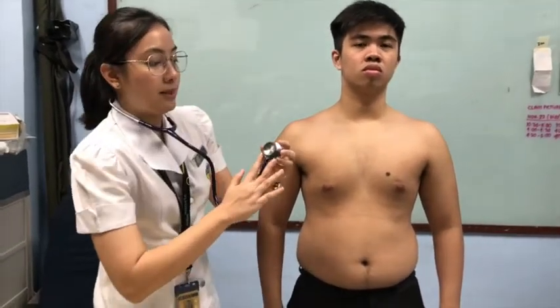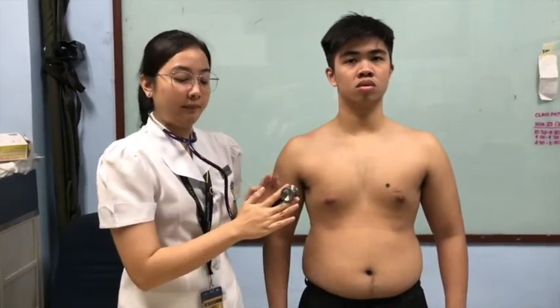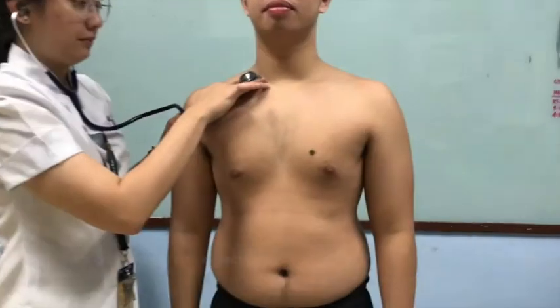We also need to remember that the proper holding of our stethoscope would be in this way so that our hands are away from the patient's body. And then it's also important to tell the patient that upon auscultation, it's supposed to be your normal breathing. So relax, normal breathing. Now we will be following the proper steps of auscultation for the anterior portion.